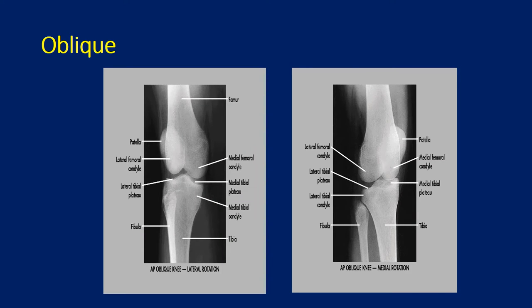Oblique views of the knee are probably the least useful view. They are taken when there is lateral or medial rotation of the knee. When there is medial rotation, you can see the proximal tibia-fibula joint very well. And when there is lateral rotation, you can see the medial compartment well.